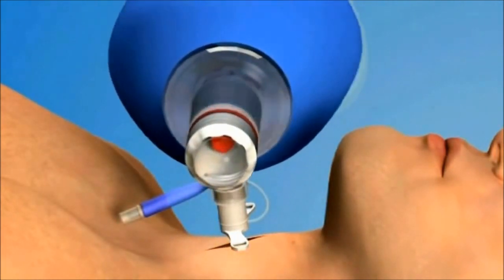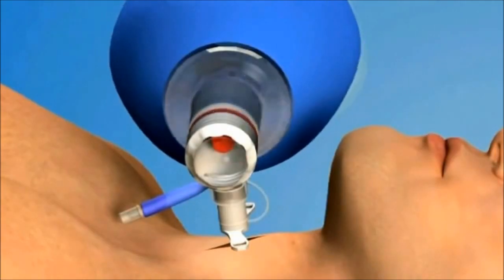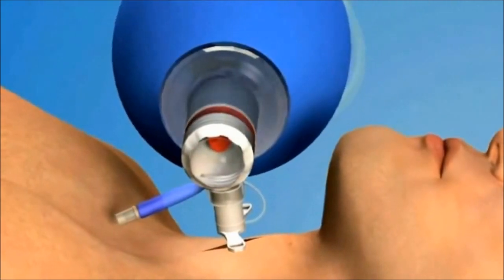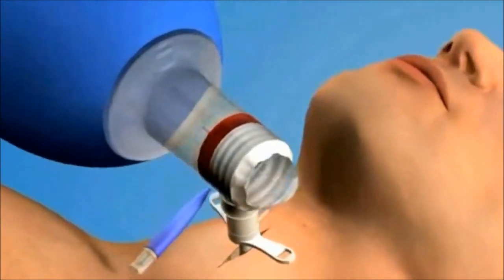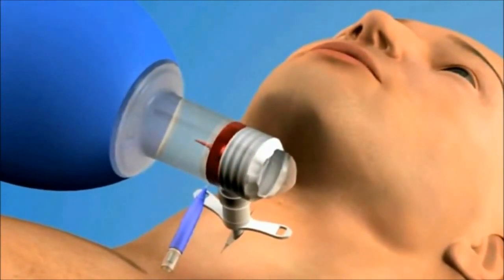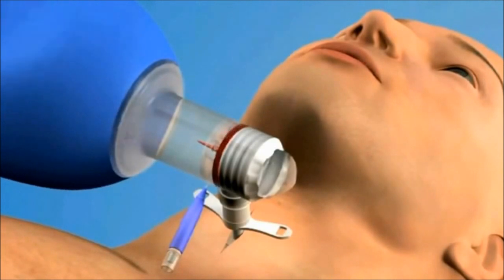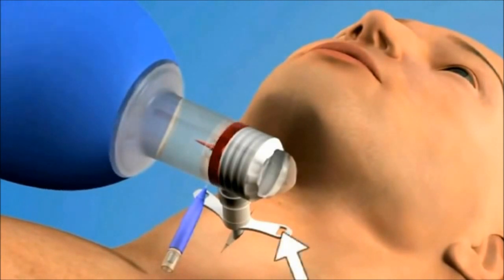Proper catheter placement may be confirmed using auscultation and end tidal CO2 detection. Secure the catheter to the patient using cloth tracheostomy tapes that have been threaded through the flanges of the catheter.